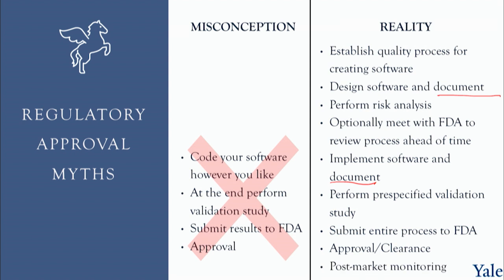But even at that point, we have to have a system in place for post-market monitoring, getting inputs from our customers if things are going wrong, to maintain and support our software. So as you can see, the process starts a lot earlier than coding the software. In fact, if you look at the steps in the slide before, you'll see that half the steps happen before you even start coding. And it doesn't even end with approval. You don't just release a piece of medical software in the wild. You have to monitor it. You have to perform maintenance. You have to receive inputs from your customers because it's performing a critical function. So your company has to stand behind its product for a specific period of time.